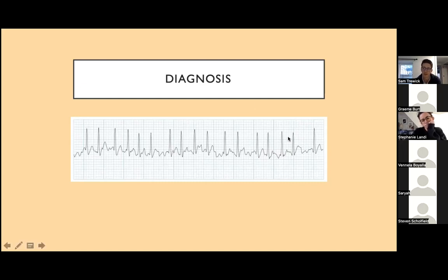24, 72-hour, maybe 24-hour monitoring. Yeah, that's right. We can set something up so that they've got a tape at home, and we call it a Holter monitor. And our decision of how long to monitor is dependent on how frequently they have the symptoms. If they say that over the last month they've had symptoms once a week, there's no point putting a 24-hour tape on them, because you've only got a 1 in 7 chance of capturing whatever symptoms they might have.